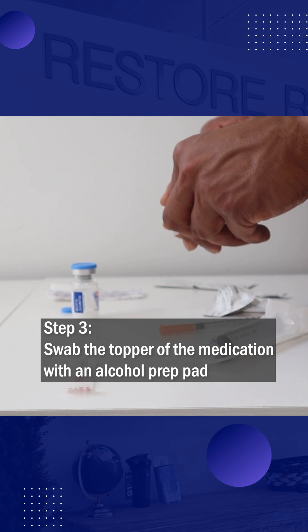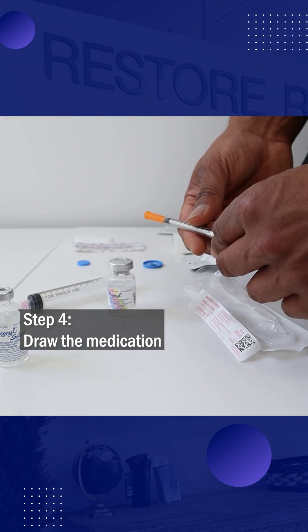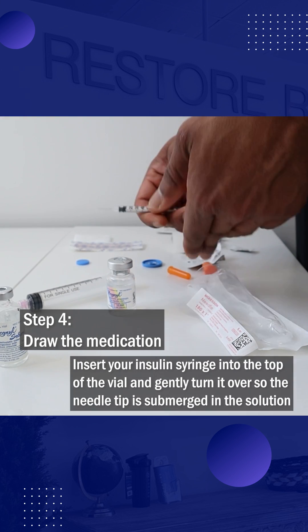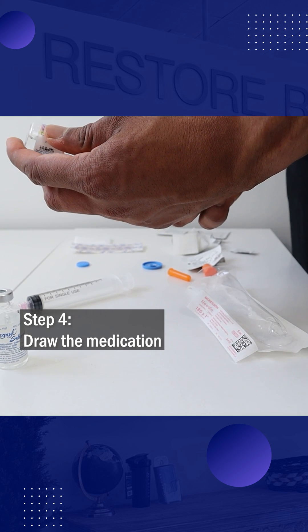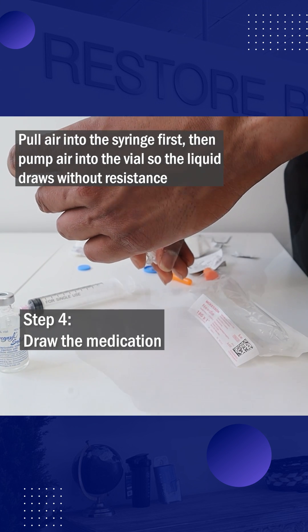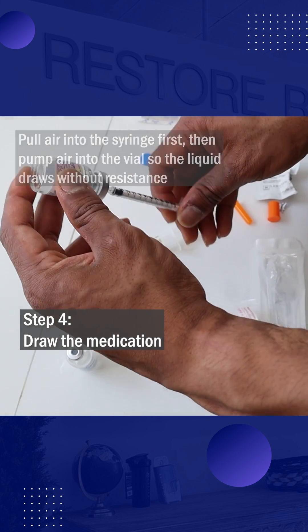Before drawing, swab the rubber stopper of the medication vial with an alcohol prep pad. Next, insert your insulin syringe into the top of the vial and gently turn the vial over so the needle tip is submerged in the solution. Pull air into the syringe first, then pump the air into the vial before drawing to allow the liquid to draw without resistance.